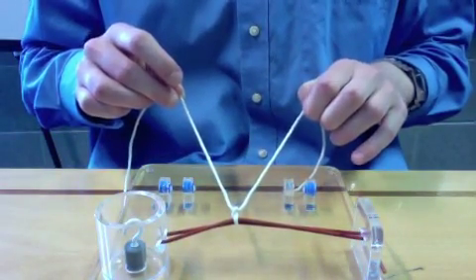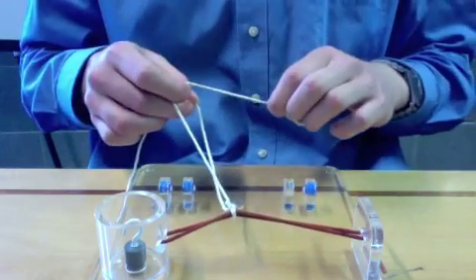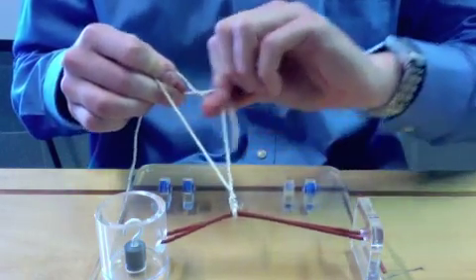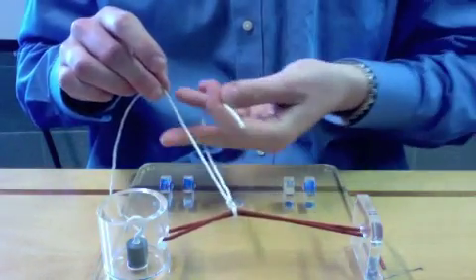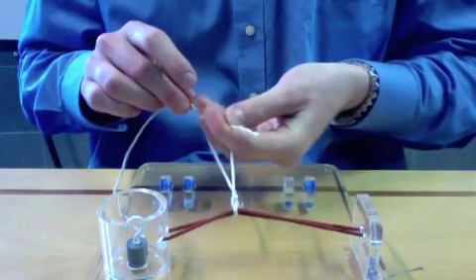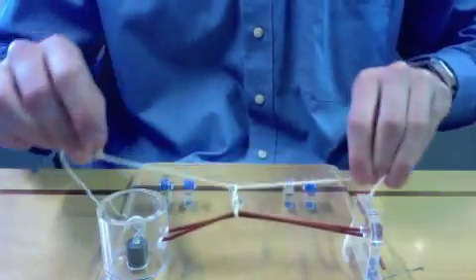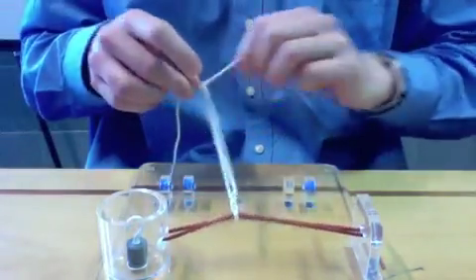Stage 1, left over right. Figure 4, through the loop. Stage 2, wrap around, hook, pull through, close the loop.